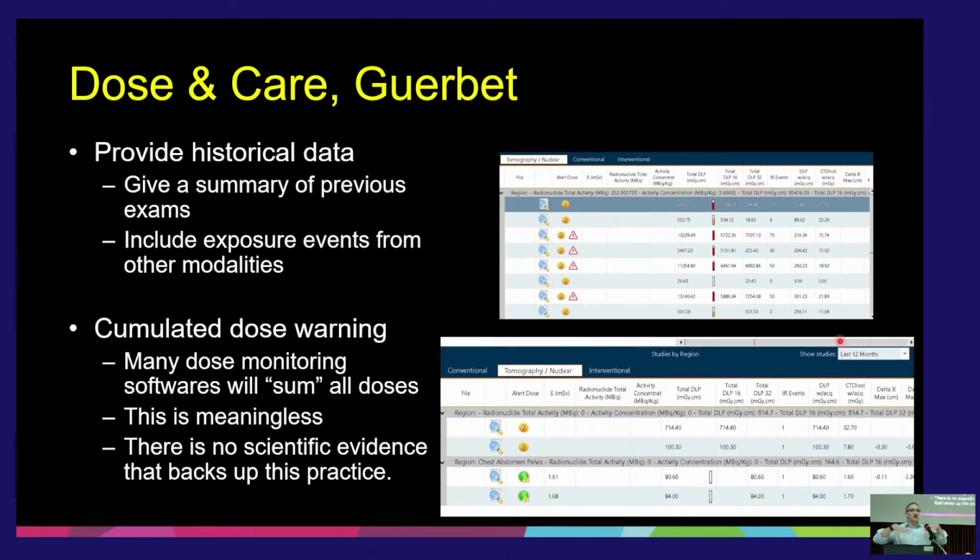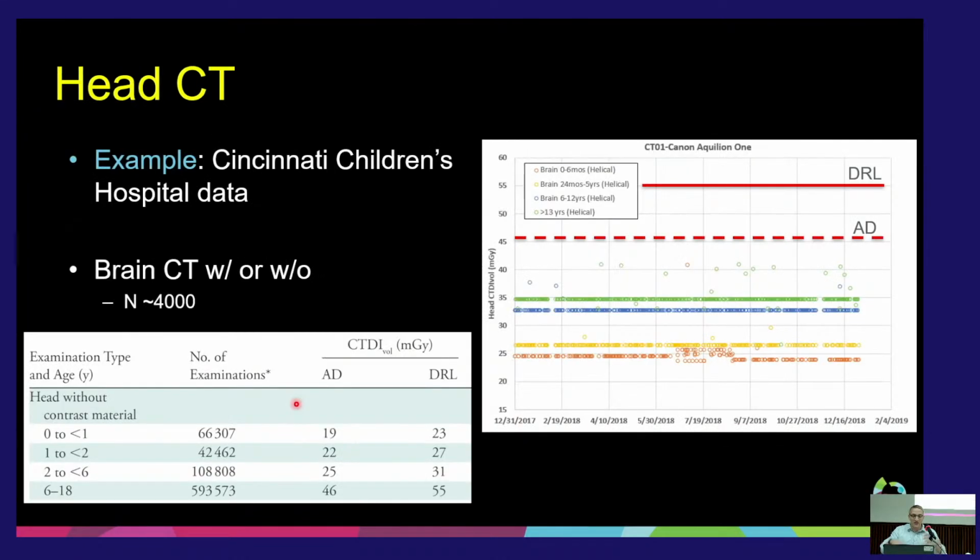So it shows you the totality of what the patient's receiving when you start to drill down to the actual patient stuff. Once again, this software actually gives me a sum, and I don't like that, but it does provide you some kind of way to look at the total amount of dose that's happening.